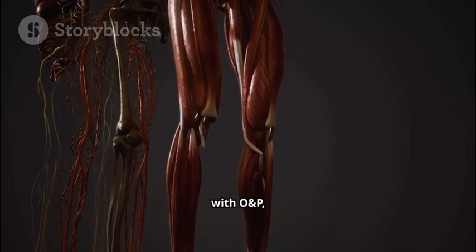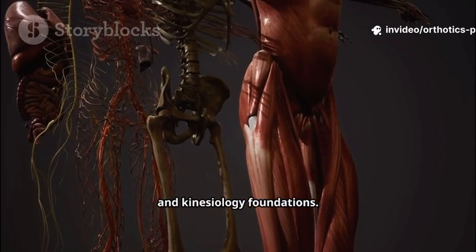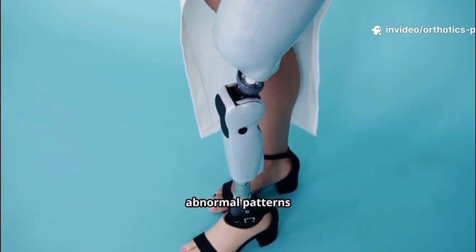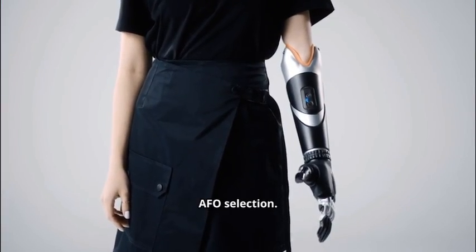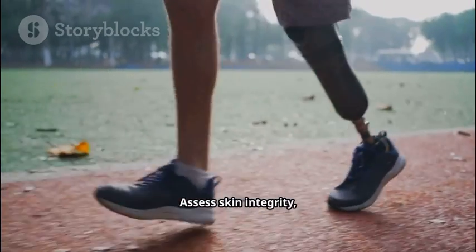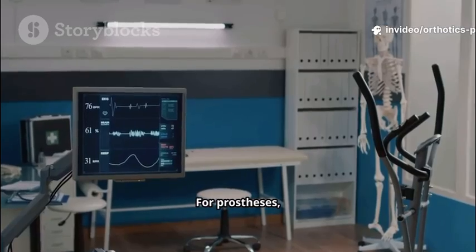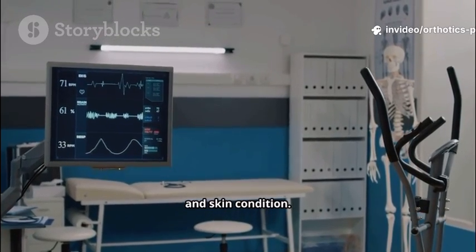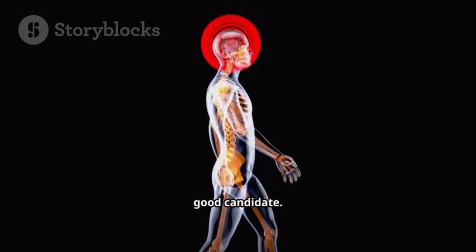To work effectively with O&P, build strong anatomy, biomechanics, and kinesiology foundations. Understand normal movement to identify abnormal patterns and device needs. Foot and ankle biomechanics guide AFO selection. Assess skin integrity, muscle strength, range of motion, and sensation. For prostheses, evaluate residual limb shape, length, and skin condition. Thorough assessment ensures the device is appropriate, and the patient is a good candidate.